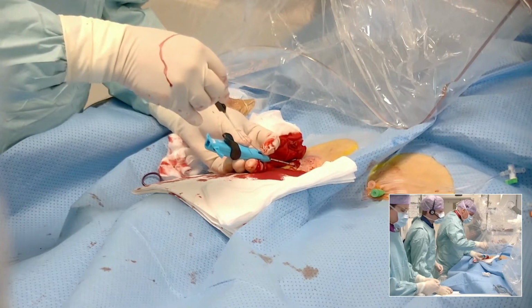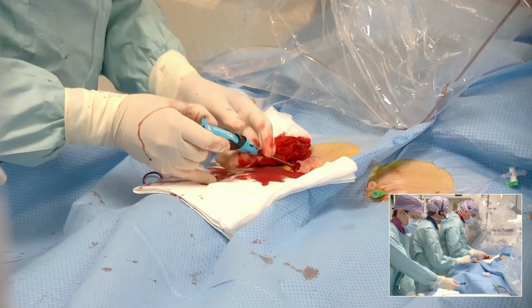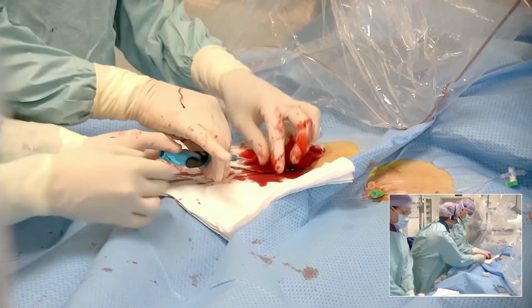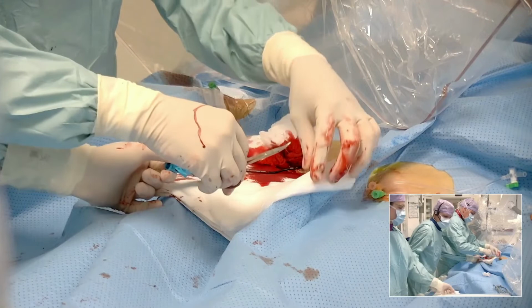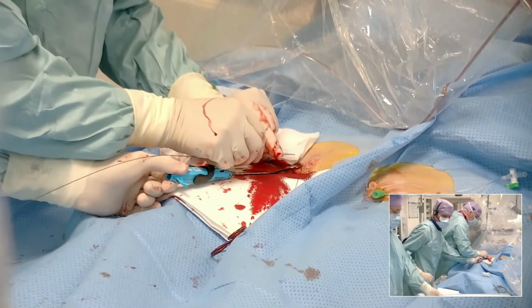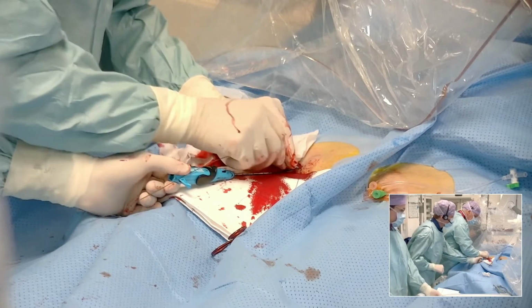So what Lars also did is he torqued a tiny bit less, not the classical 10 and 2 o'clock as we talked about, but more an 11 and 1 o'clock torque. And now the second suture is in line, pre-closure. Now we take the J-wire. And then we're going to go with a 12 French.